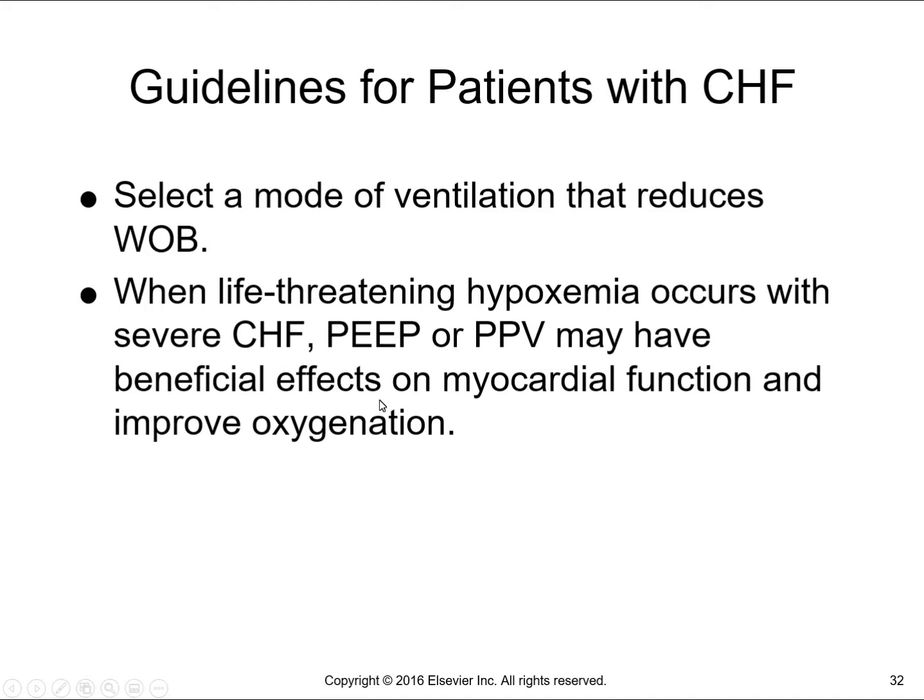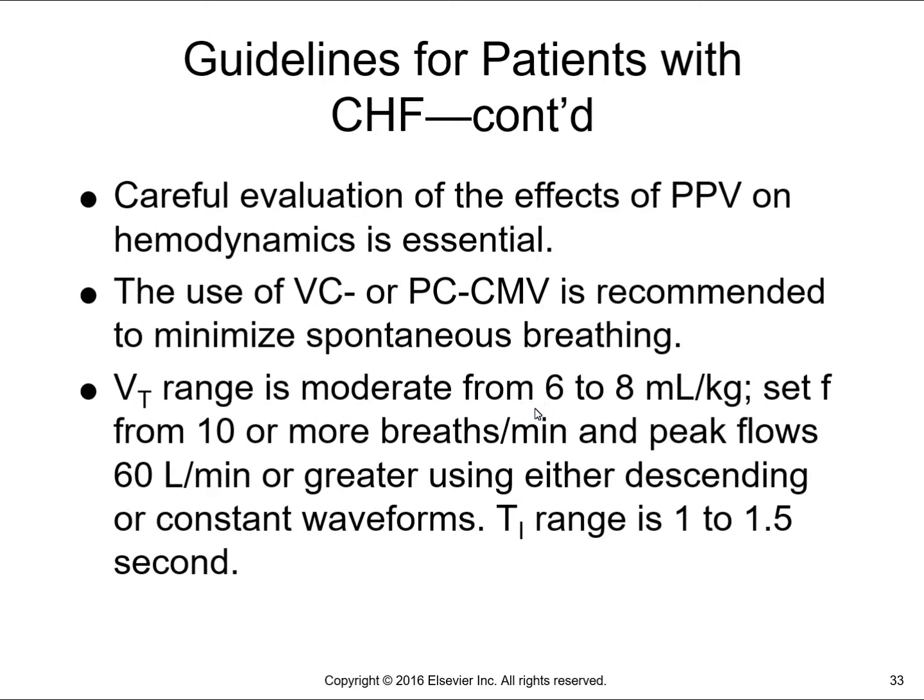The beneficial effects are that we get to push fluid out, as well as have more alveolar recruitment, so that's going to increase our oxygenation. All right, so careful evaluation of the effects of positive pressure ventilation on hemodynamics. Primarily we're thinking about PEEP, because if I ramp up on my PEEP, I can start to put pressure on the heart, therefore it's going to decrease cardiac output.